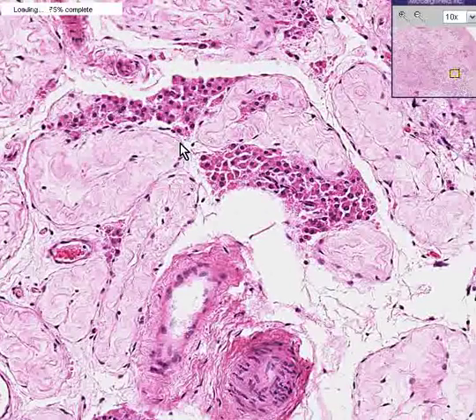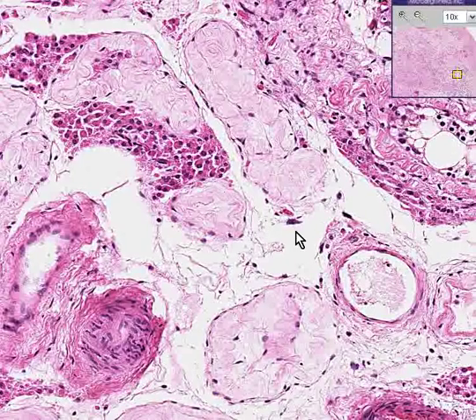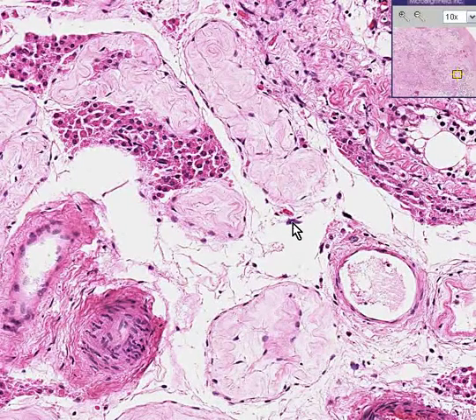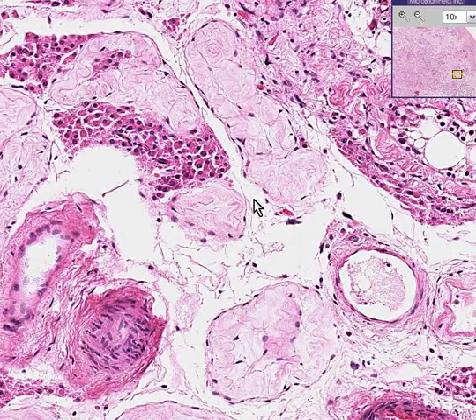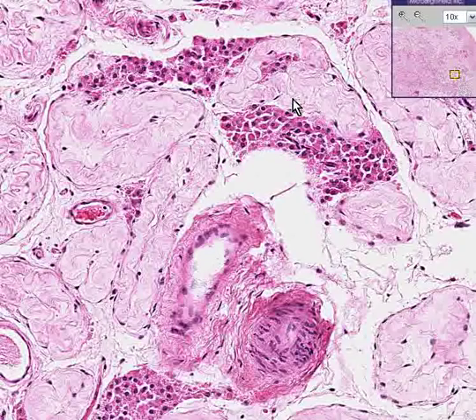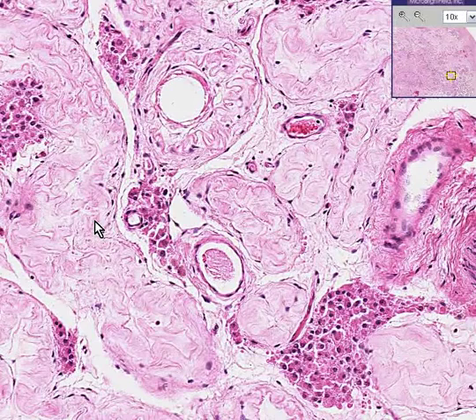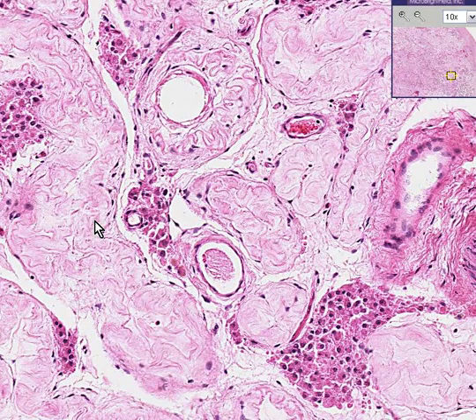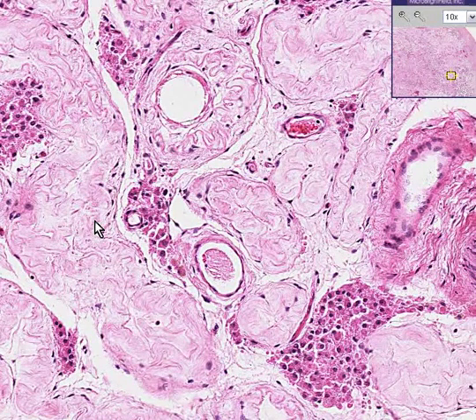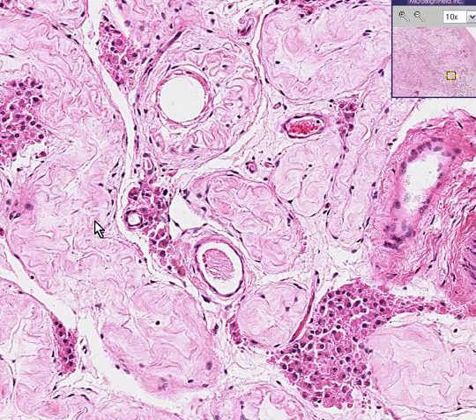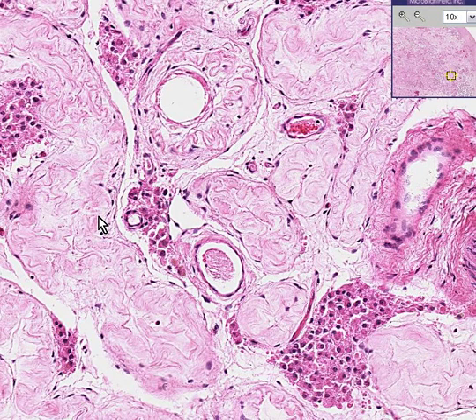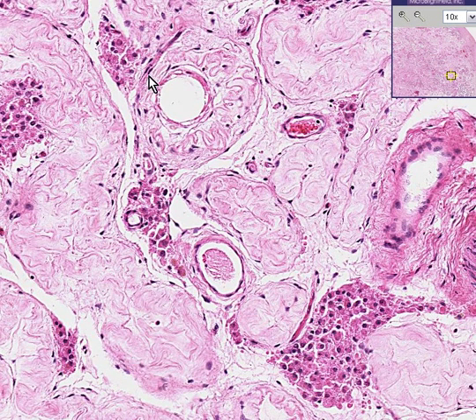This is a very classic pattern for testicular atrophy caused by a whole variety of things, and I'm sure there are probably 20 or 30 on the list, but I could probably think of three or four. These are old age, radiation, chemotherapy, or administration of hormones which counteract testosterone, which are estrogens. These are all common causes of testicular atrophy, and this is a very classical appearance of it. Thank you very much.